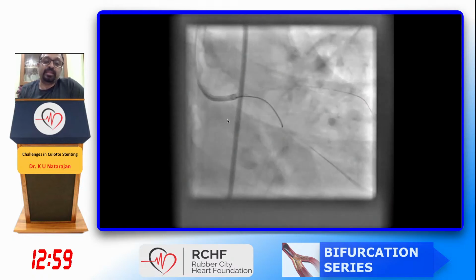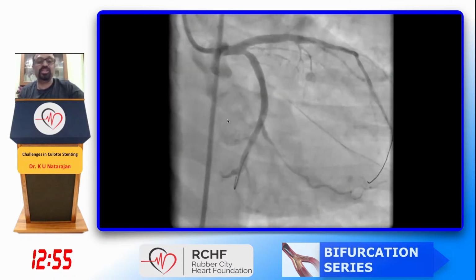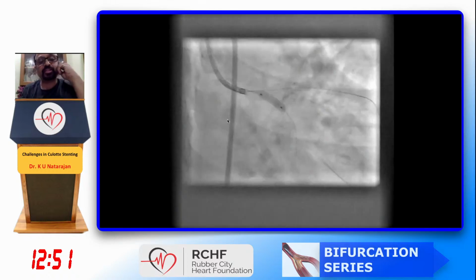And we wired the circumflex. We made sure that we were not abluminal by StentBoost images. And we dilated with a smaller balloon.